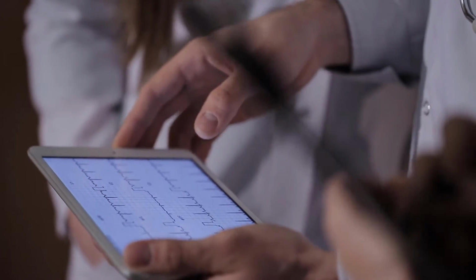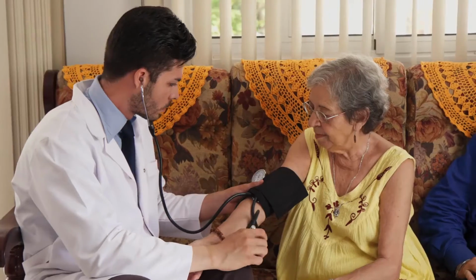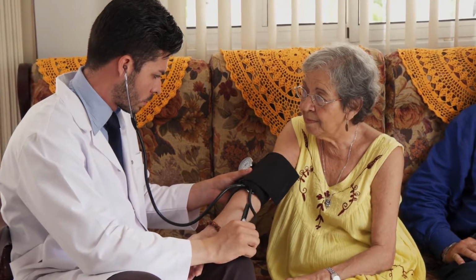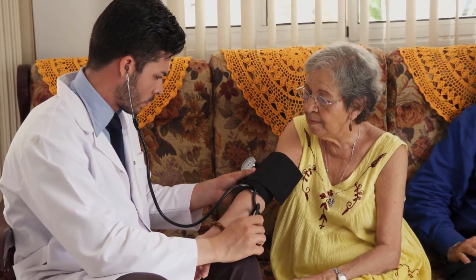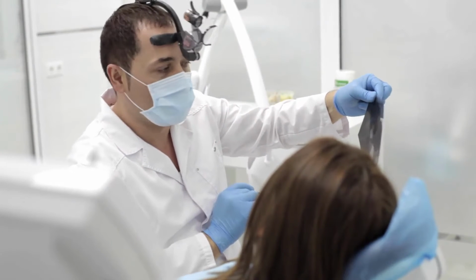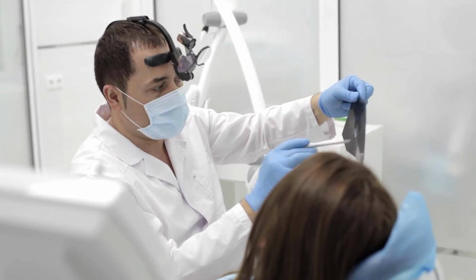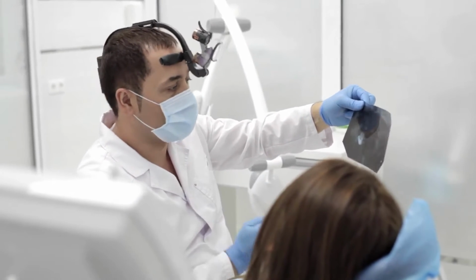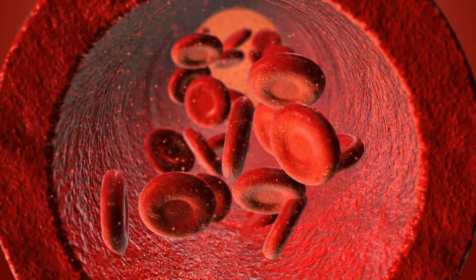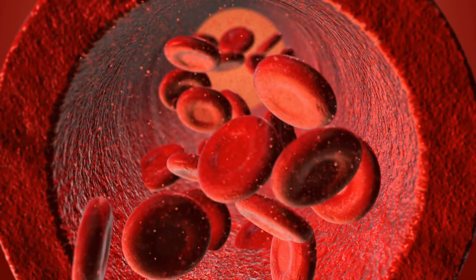Positron emission tomography scanners detect photons of light energy and build three-dimensional images from the photons they receive. Scientists can use this ability to detect photons for medical diagnostics if they know where the photons come from and what they represent. A normal person under the scanner does not emit enough photons for the scanner to build an image that shows up tumors or other medical conditions. Therefore, the patient under investigation must receive a photon energy source in an injection. The injection contains a form of sugar that is radioactive. This sugar is the FDG part of the scan.